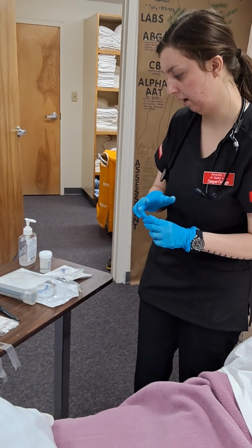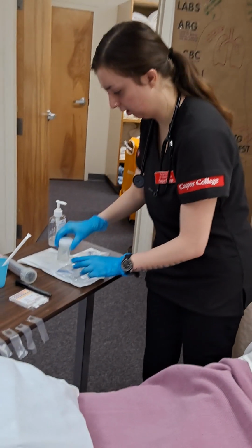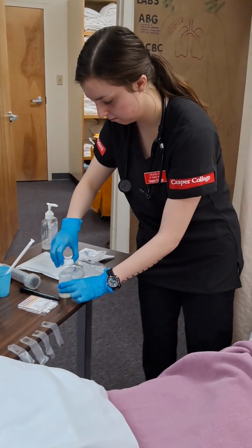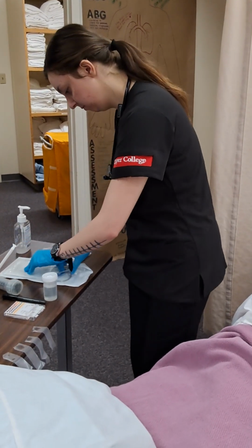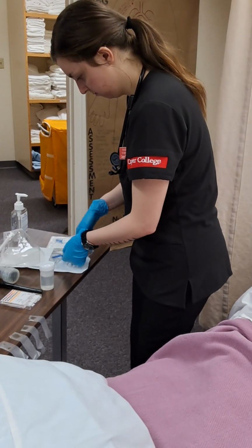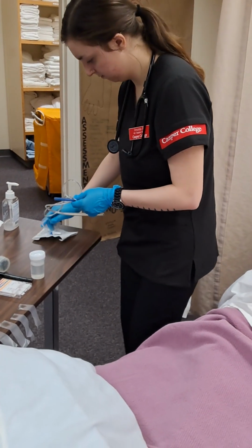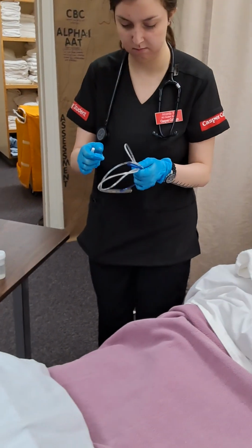So now I am going to get my supplies ready. I'll open up my NG tube. On my anti-reflux valve.